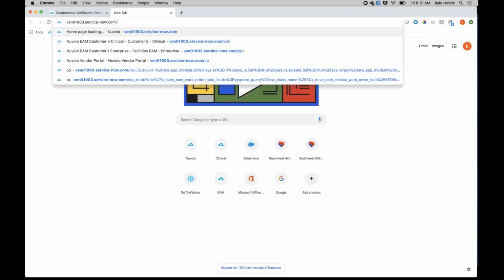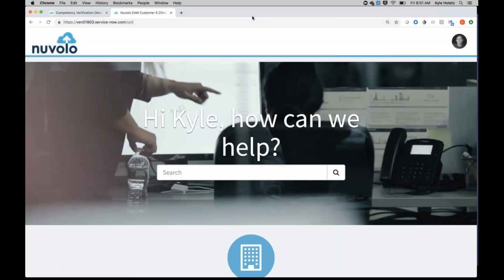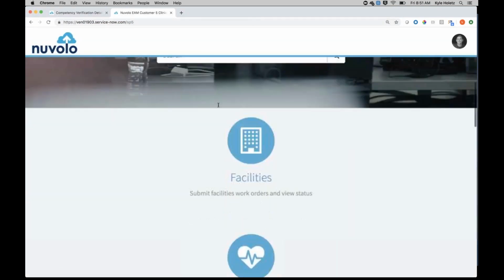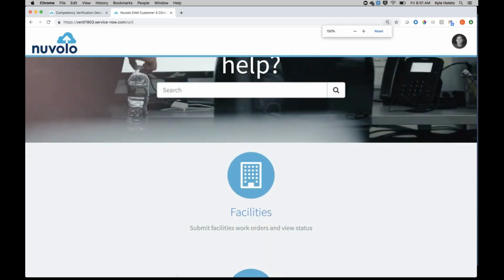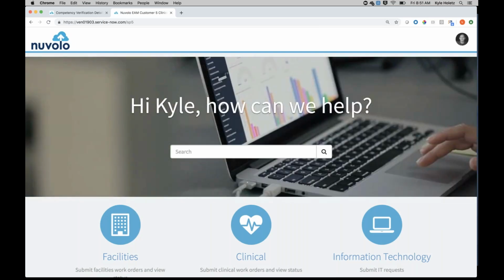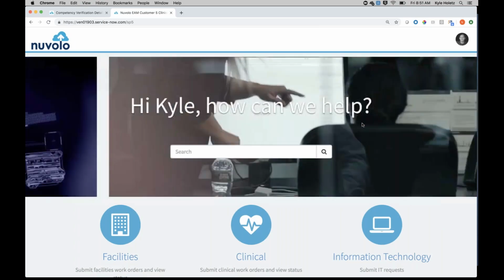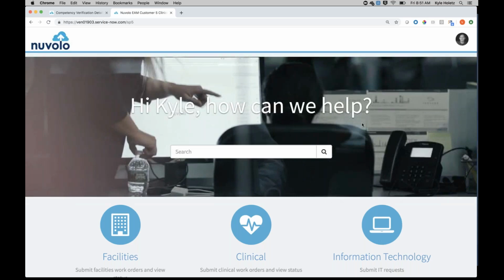So we actually do a self-service portal for inbound requests. I kind of addressed one of the other comments that was made earlier, around having common things that we can allow them to check rather than just ready and broken. But your second piece, we do route work based on a number of things. One, we'll route based on site, modality of device, skill availability. So we actually pull in data from Chronos, Workday, or a timekeeping system to know what technicians are available for that particular assignment group. We can get very granular in that routing rule and process.